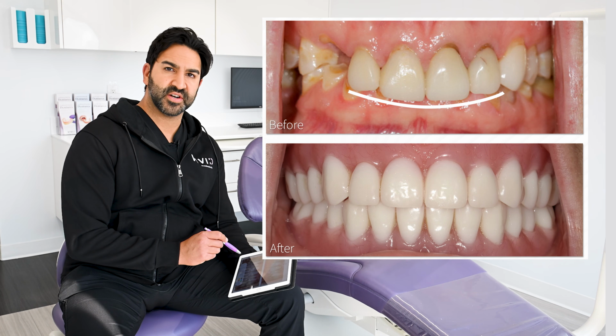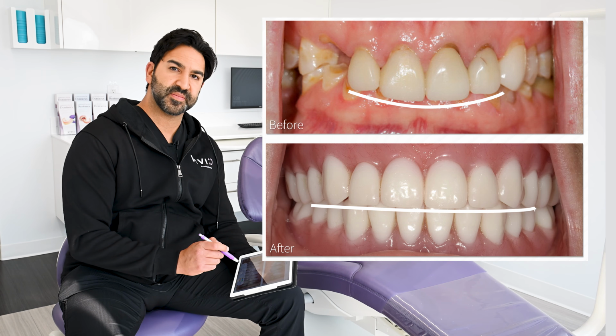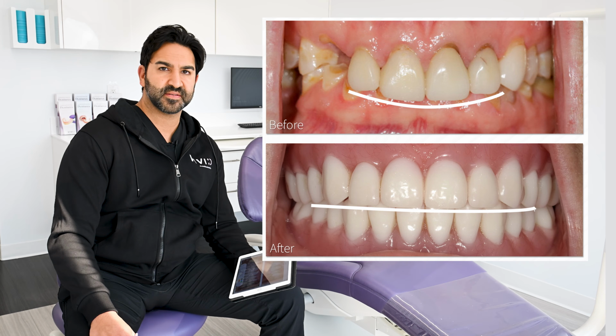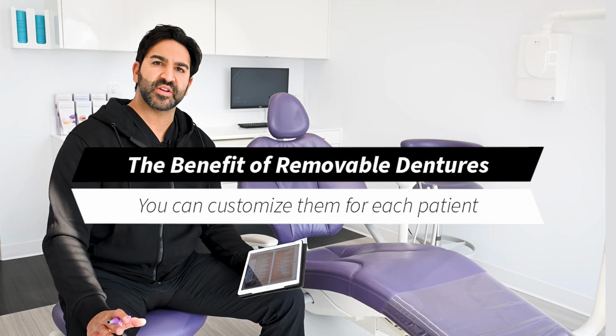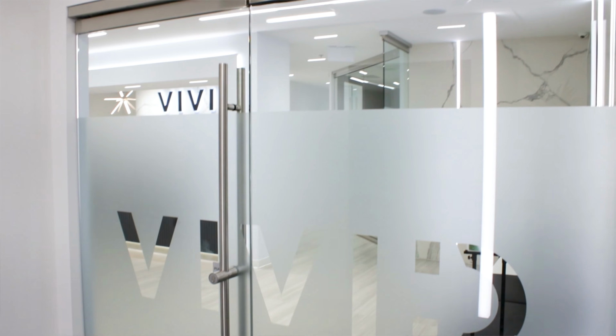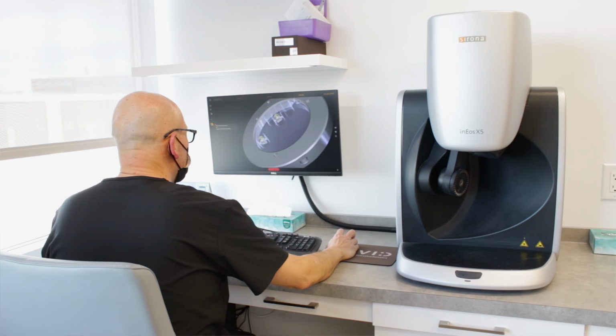In this image here, you can see the final result where we have restored the vertical dimension of occlusion and we have created a near perfect bite. The benefit of removable dentures is that we can customize them for each patient. This includes both the positioning of the teeth and the shade. Our in-house dental laboratory ensures that adjustments can be made right away for each one of our patients.